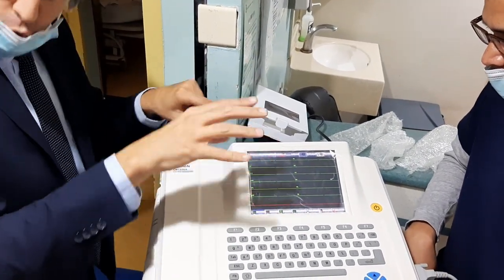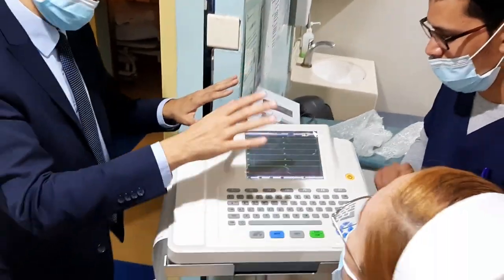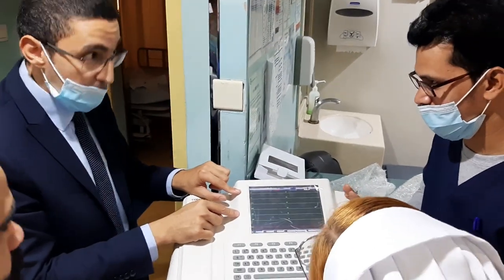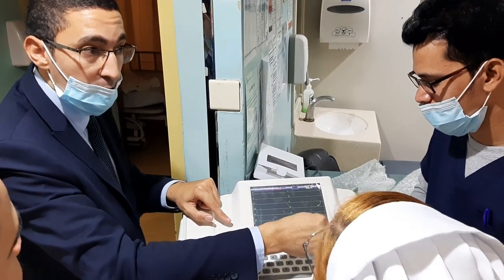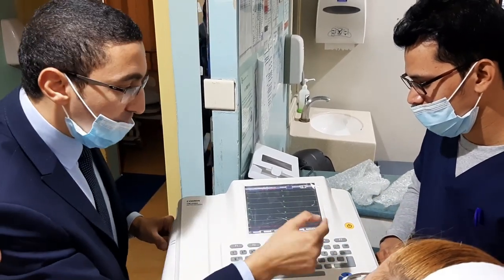This is the default. Most doctors, all the hospitals, like this one especially. And here it is lead 2, so this long strip. So we'll show you how to bring it.